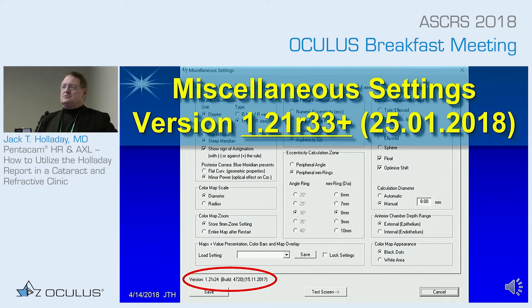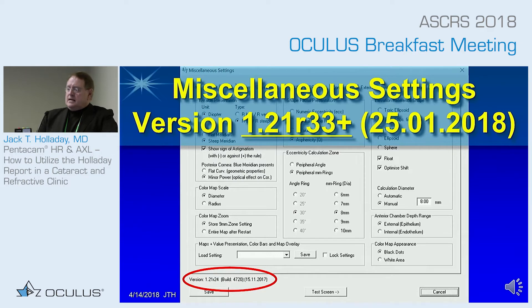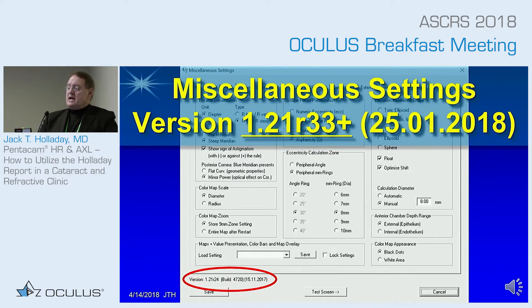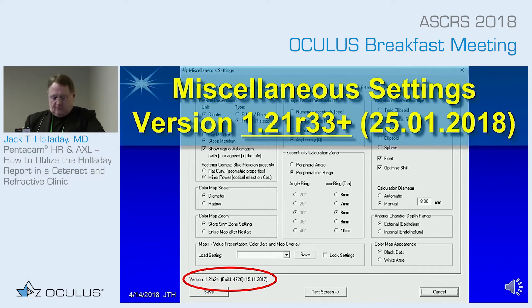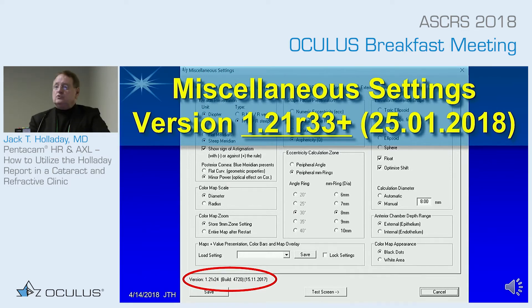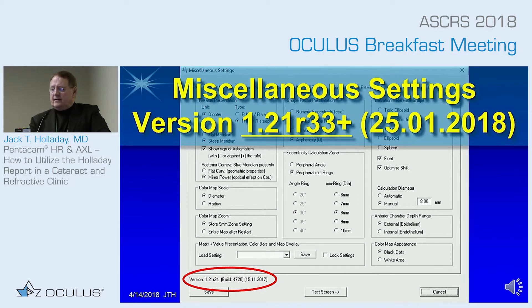What we will be discussing is a report that's version 1.21 revision 31 or higher. The ones before that won't have some of the new features that are available, so it's important that you have that version.